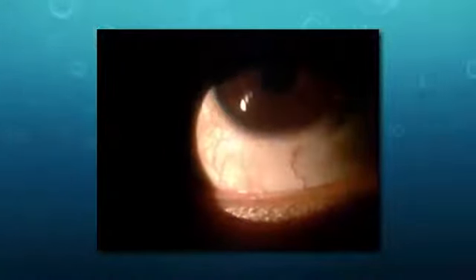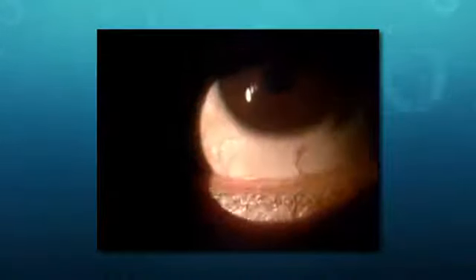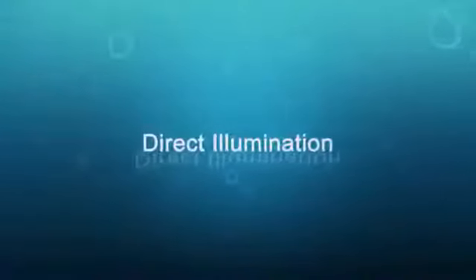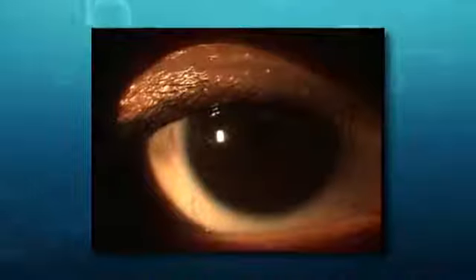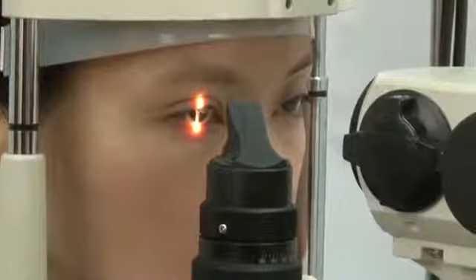It is also commonly used for contact lens fit assessment, for example, centration, movement, and coverage. The second type is direct illumination. The light source and observation focus coincide on the same spot on the eye regardless of the position of either system. Direct illumination can be subdivided into the following techniques.